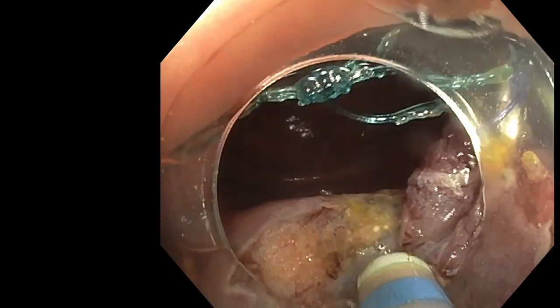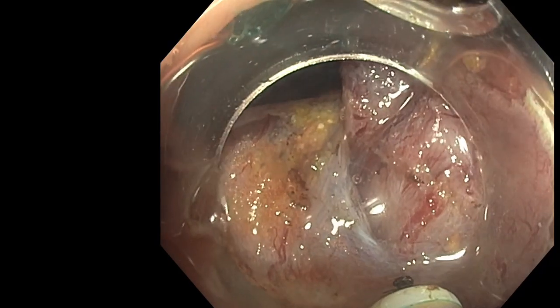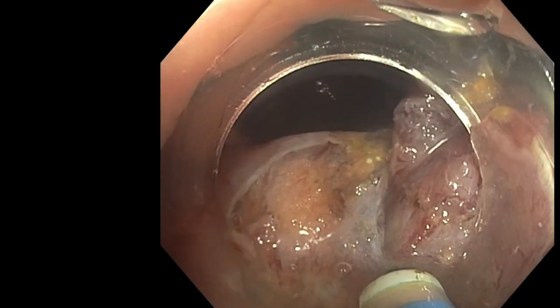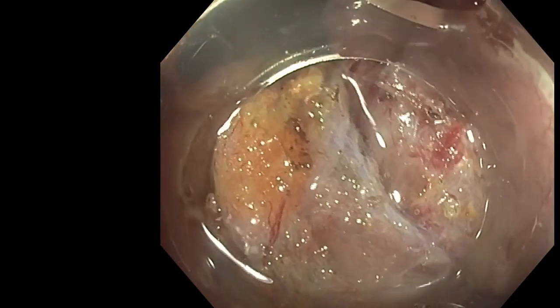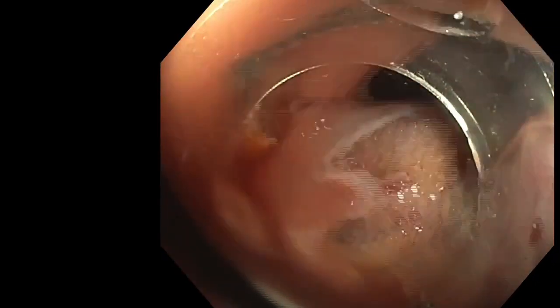So once again we can inject, we can cut the submucosal fibers, and you can see that we have the entrance of the diverticula here with a submucosa all around the diverticular mucosa.